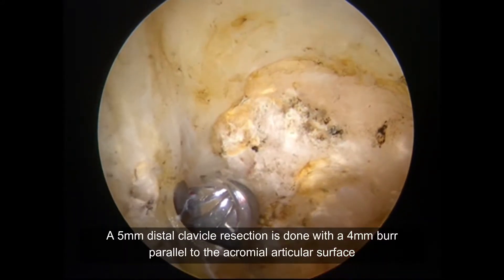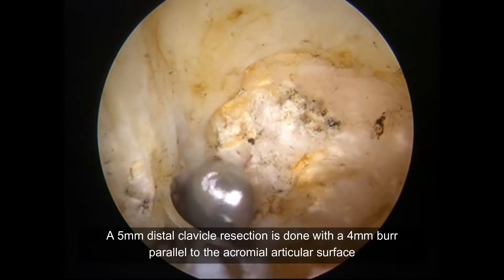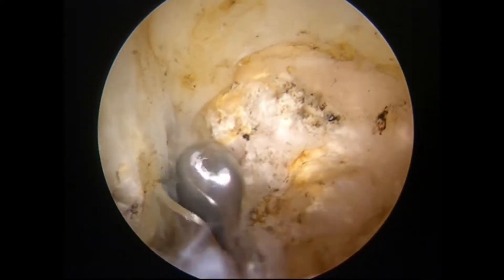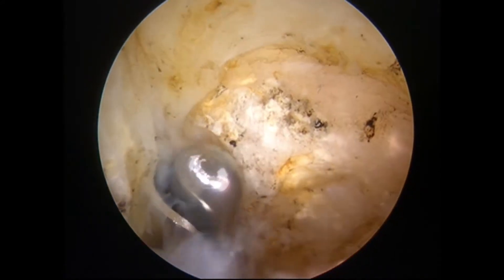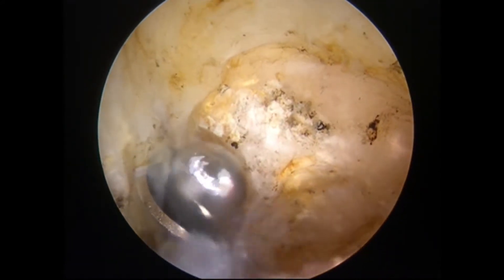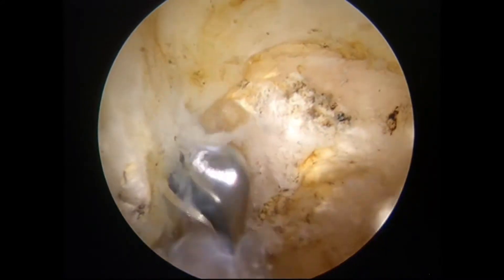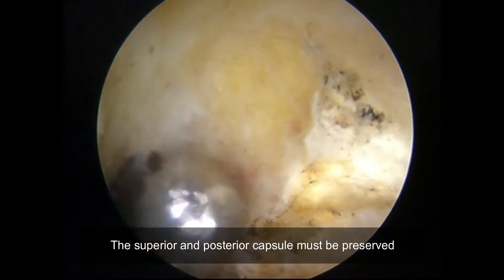A 5mm distal clavicle resection is performed using a 4mm burr, oriented parallel to the acromion articular surface. The superior and posterior capsule must be preserved throughout this step.